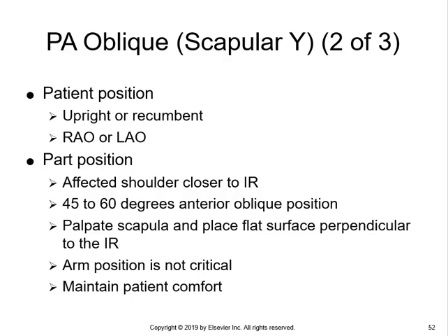Most technologists, in my experience and in the Tyler area anyway, shoot theirs AP, which means that if you use the PA, then you're kind of the odd man out. And certainly that applied to me when I was in clinical practice. So if you shoot yours PA as opposed to AP, it might be a good idea to mark the image so that the radiologist knows which Y view you actually performed. Otherwise, it may look like it's backwards to him, and it looks to him like you mismarked your image.